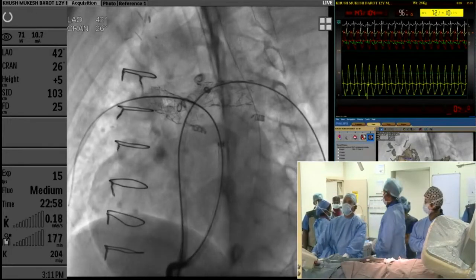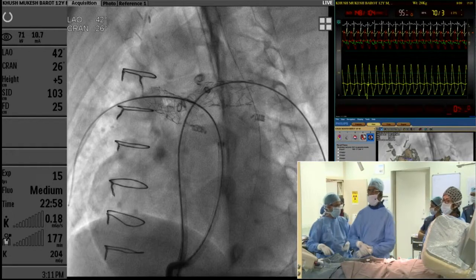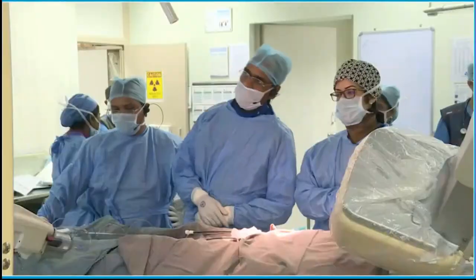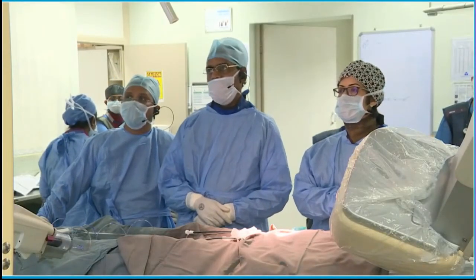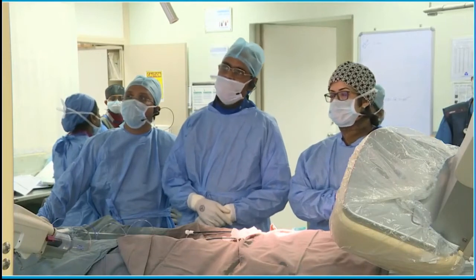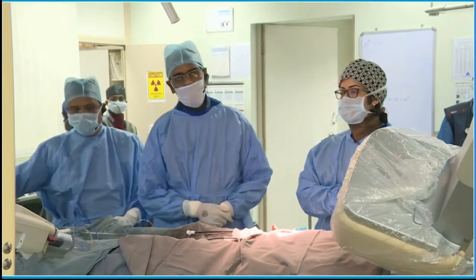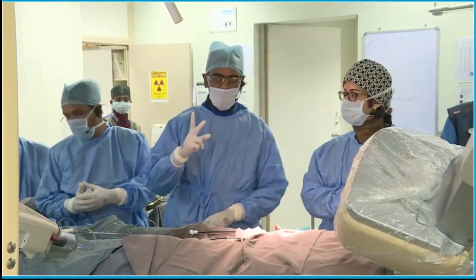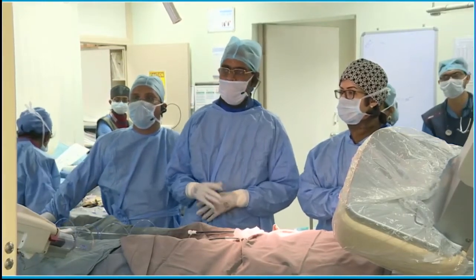Okay, let me do an Atlas. Atlas 14 into 2. Can you give me an Atlas 14 into 2? The only issue, Shiva, is if you have an ordinary Atlas, it has such a big shoulder. Yeah. That it gets into, but if you have a gold, it really works out very well. I don't have a gold, but I will use an ordinary Atlas. I'll take a 14 into 2. So then on either side, there is going to be 4 centimeters.